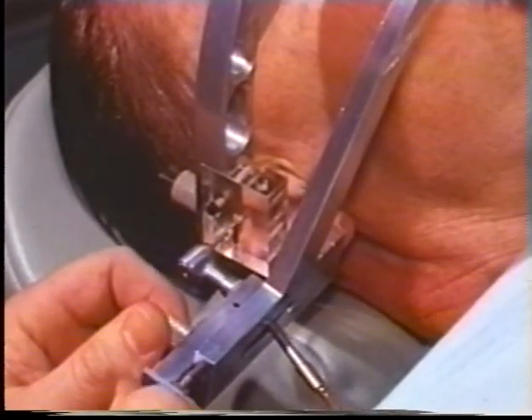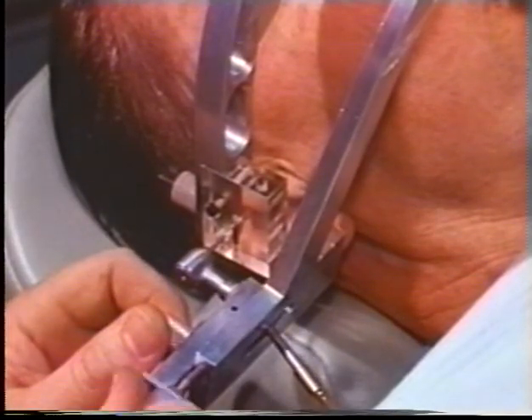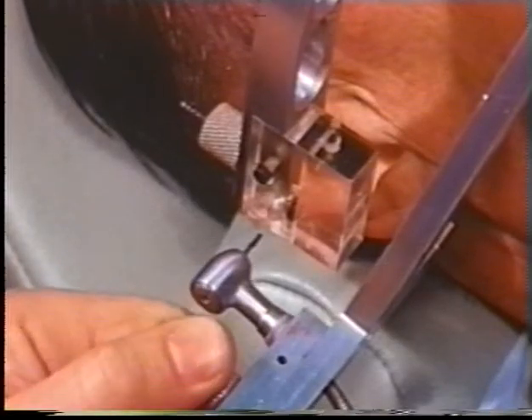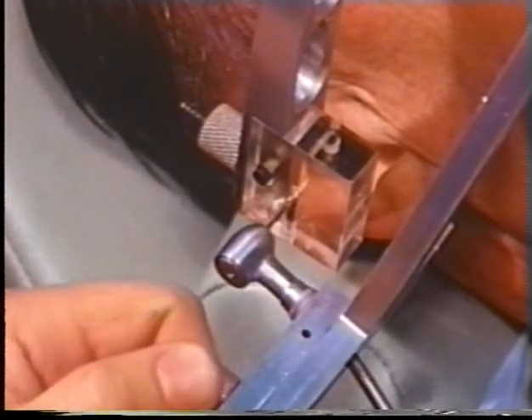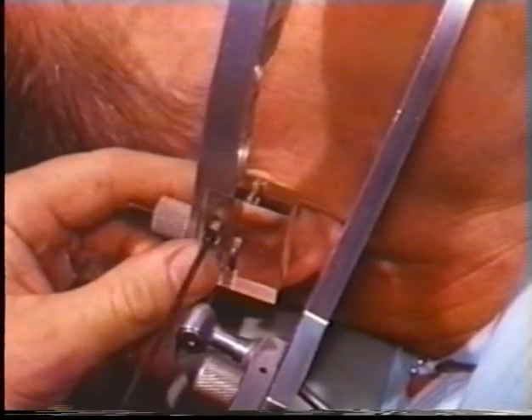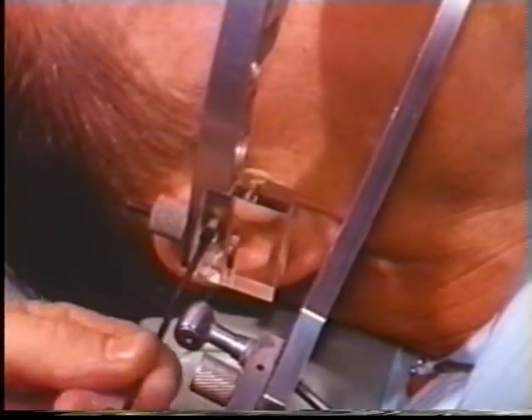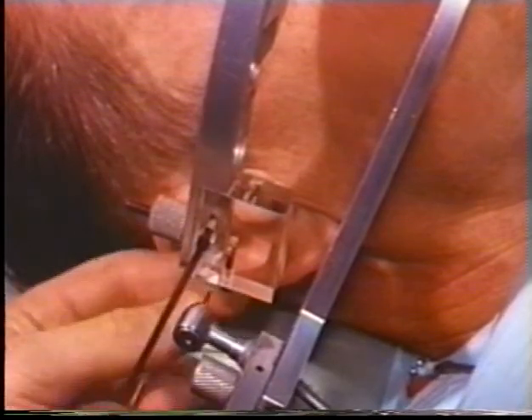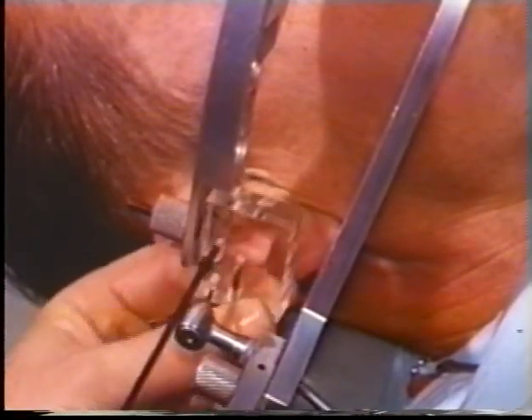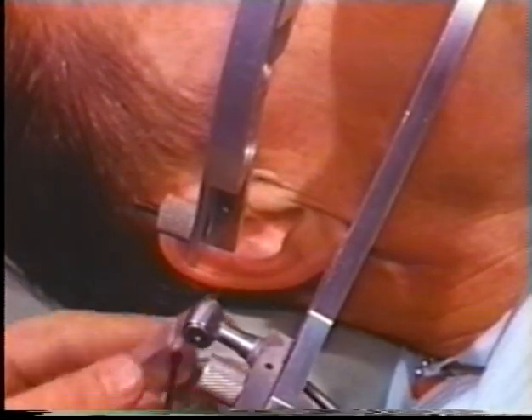The drills are retracted from the alignment blocks, thus leaving the lower bow supported totally by the mandible. The mandible is retruded and the drills reinserted to check the accuracy of the axis mounting. The drills are again retracted so that the alignment blocks may be removed and replaced with recording blanks.